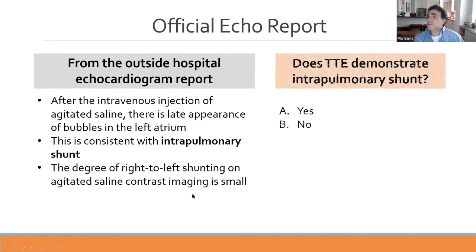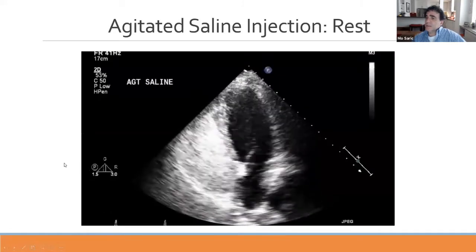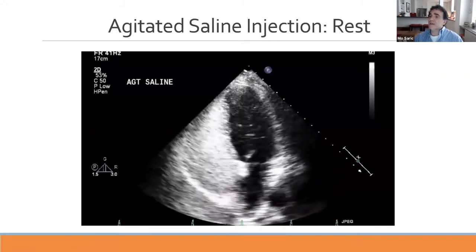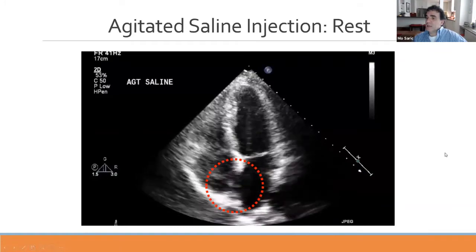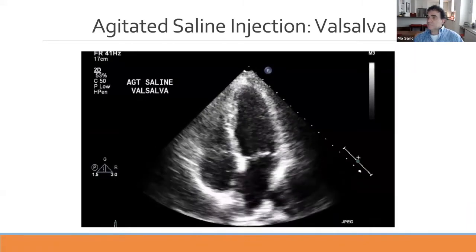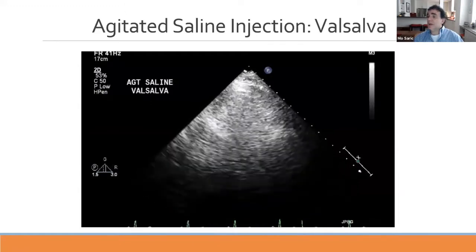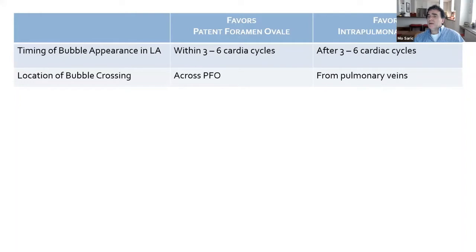Looking more carefully, bubbles appear around four to five beats after injection, but when they do appear, they appear in a bolus-like, intermittent fashion. There is no progressive increase in bubble amount with subsequent cardiac cycles. Furthermore, we can actually see the bubbles crossing at the level of the patent foramen ovale. The same is observed with Valsalva maneuver—direct passage at the level of the interatrial septum. Timing alone is not sufficient; we must determine whether crossing occurs across the PFO or from the pulmonary vein.